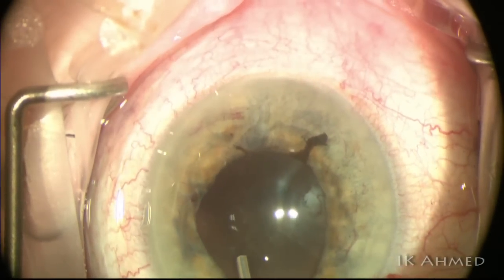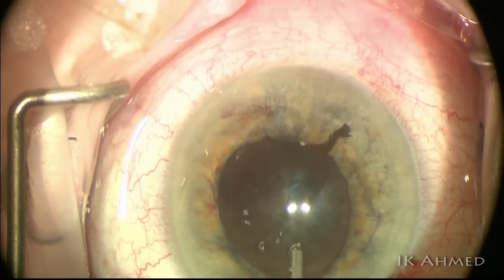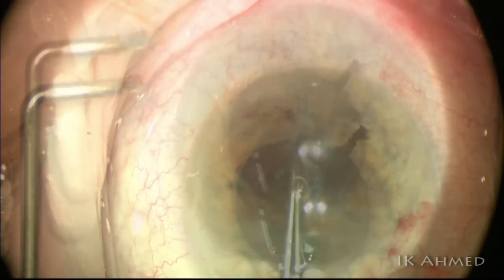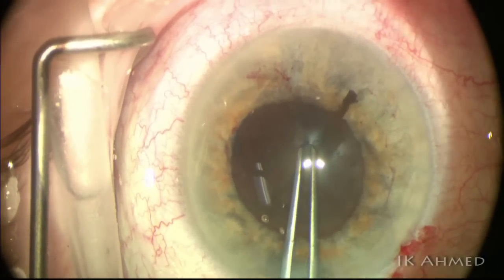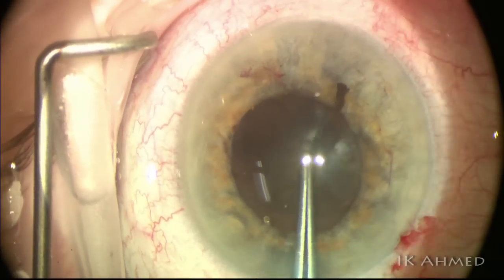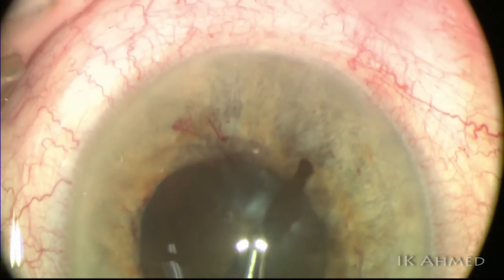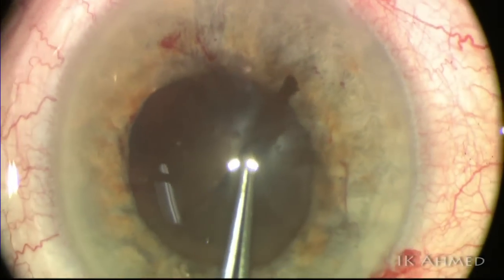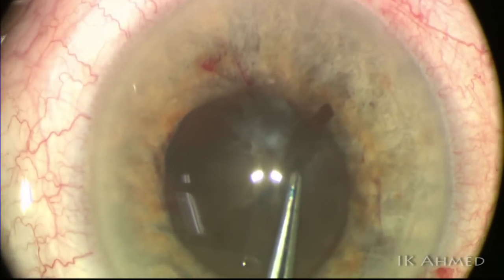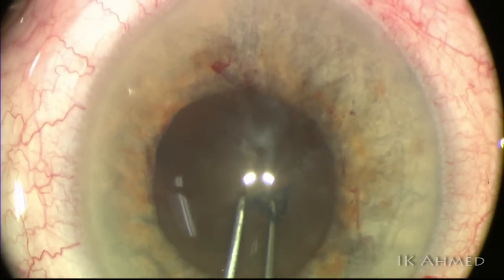We now inject some superviscous agent to visco-dilate the pupil — a very good measure to enhance pupillary dilation without mechanical means. The capsulorrhexis is started with the sharp-tip Utrata forceps. You can see a folded capsule is grasped and the tear is attempted, then continues in clockwise fashion.